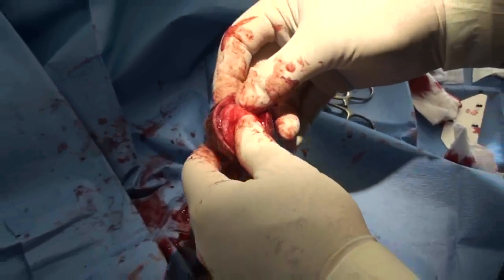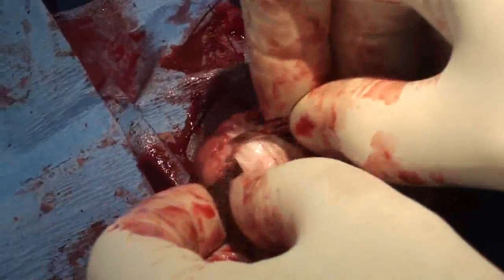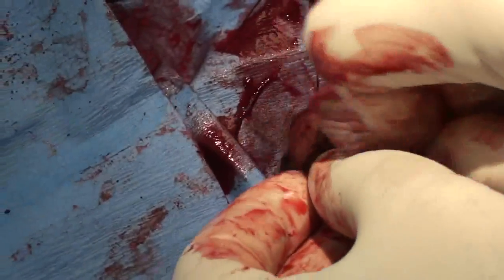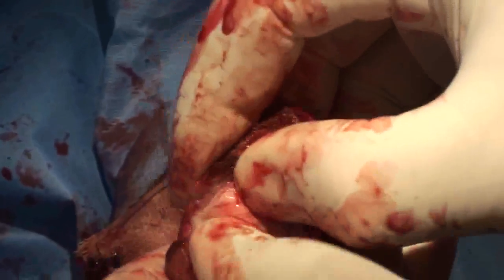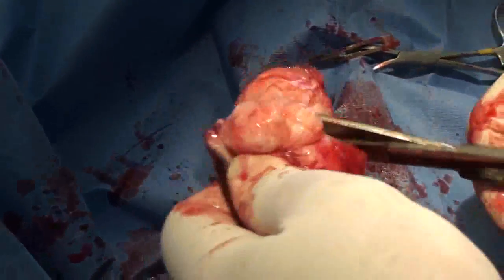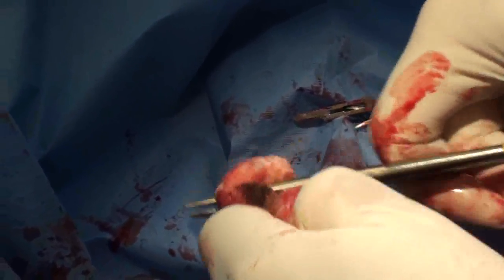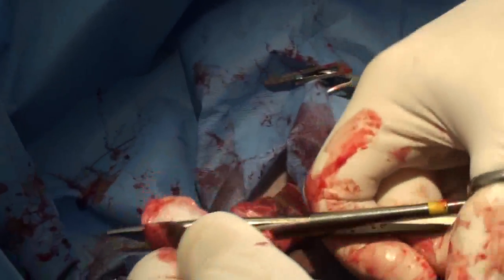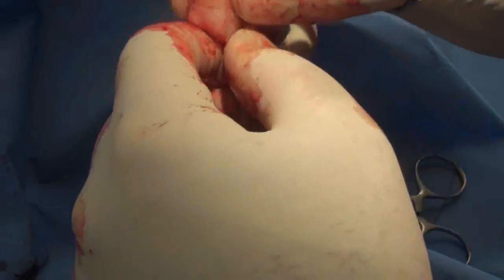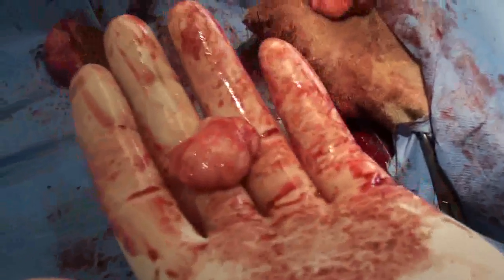Let's clear the bloody material and look at that growth. Is it scar tissue or is it a growth? I might take a piece of it and send it to the lab. I'm going to cut into it and see what it's made of — it looks like a growth. It's tough; it could be a tendon or ligament growth, but you can see that's what a growth is: just an unorganized piece of tissue. We'll send it in and see if it's something we have to worry about.